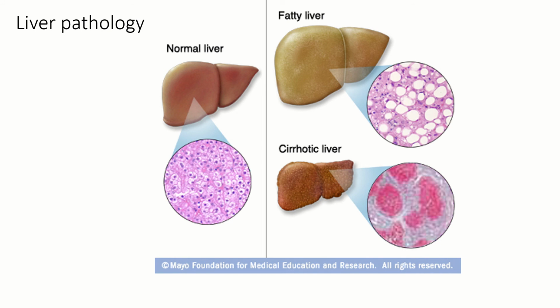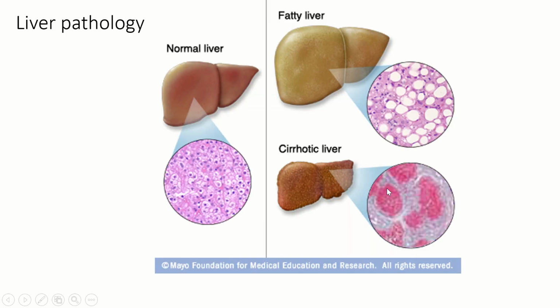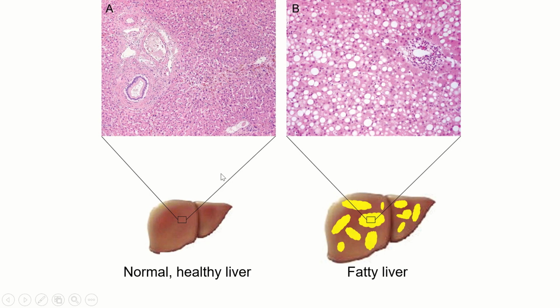So if fatty liver disease gets very bad, you're going to end up with less liver function. Now, fatty liver disease can lead to an immune response that can cause scarring, and that can cause cirrhosis. So in a cirrhotic liver, I'll show you another better slide in a moment, we actually see scar tissue building up, which of course does very clearly inhibit the function of the liver.